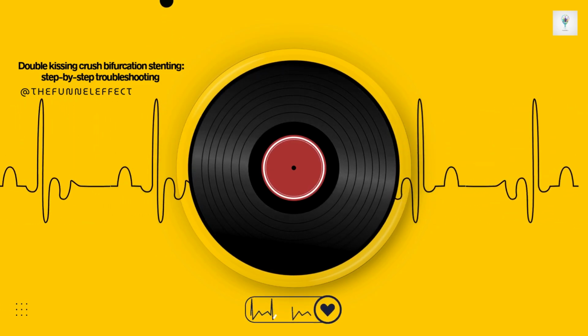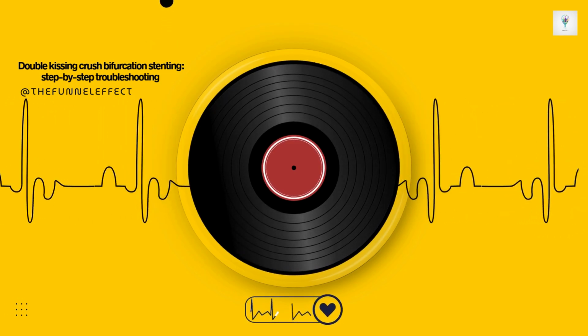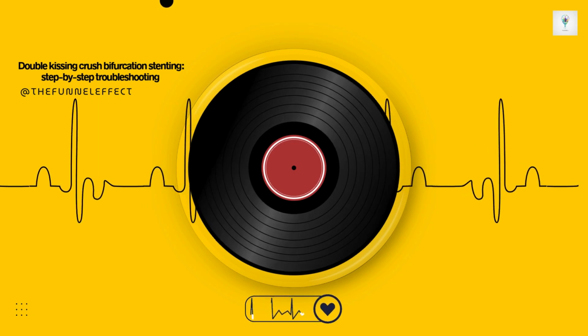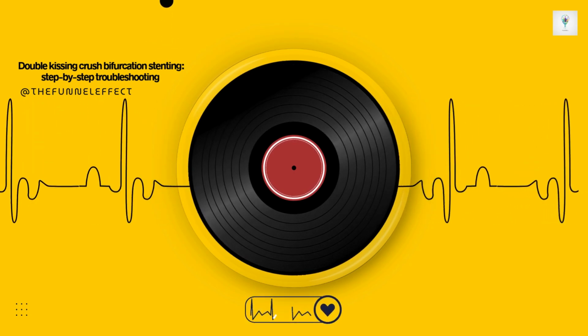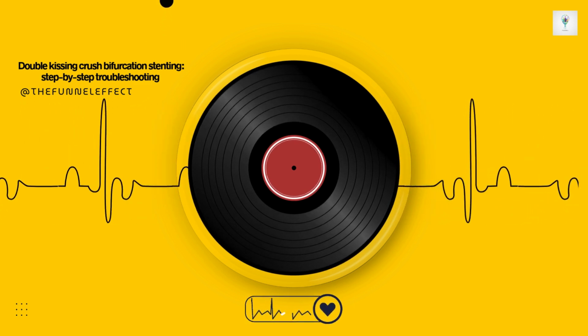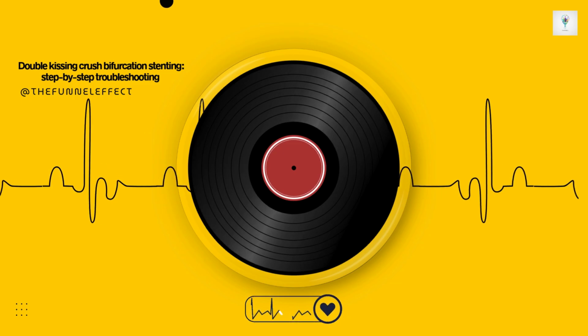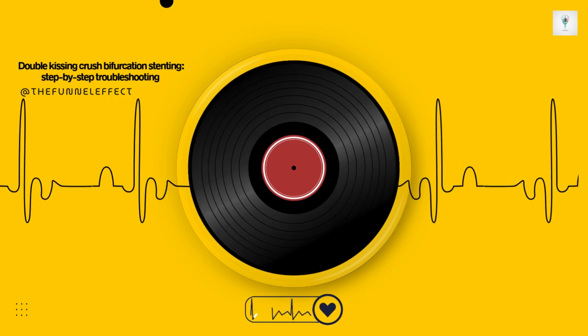Without those accurate numbers, you're basically guessing on stent size, and that's a recipe for failure down the road. Once you have that info, the action is straightforward. Wire both the MV and the SB. Secure your access. Okay, step 2, guide selection and preparation. This sounds like getting the right tools and making sure the path is clear. The source mentions maybe needing bigger guides, 7 or 8 French, often via the leg, the femoral artery, not the wrist. Why? It's all about support and friction.